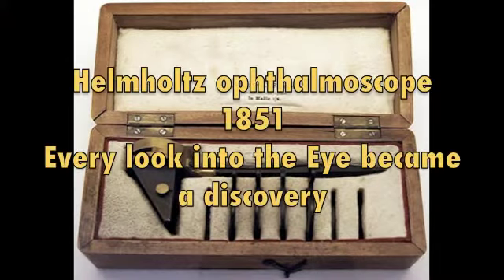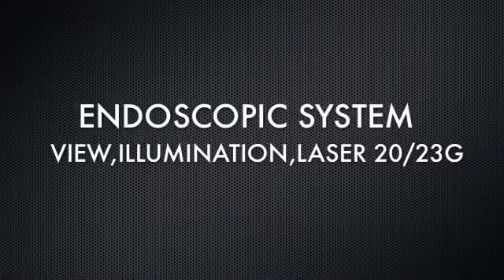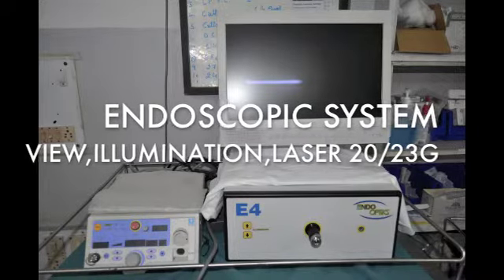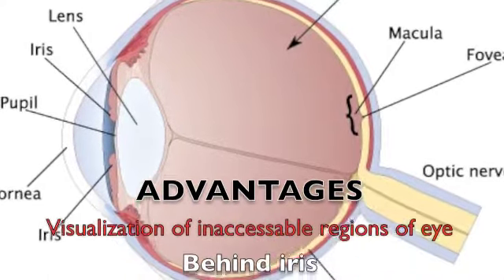Before the invention of the ophthalmoscope, the back of the eye was like a black box. Similarly, one part of the eye has remained hidden or difficult to see until fairly recently: the area behind the iris, ciliary body, ciliary processes, peripheral retina, and vitreous.